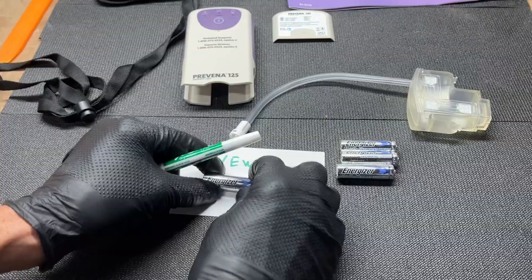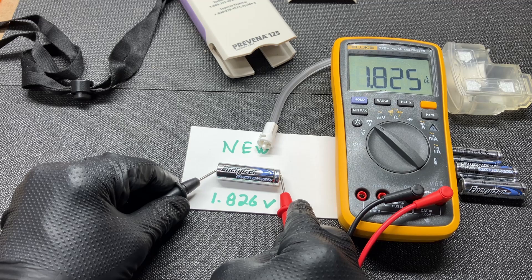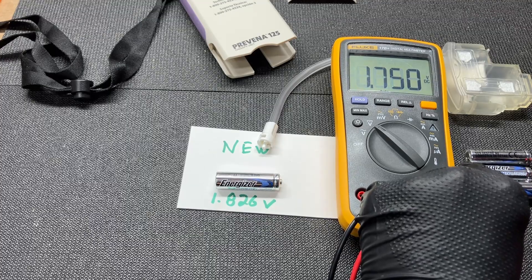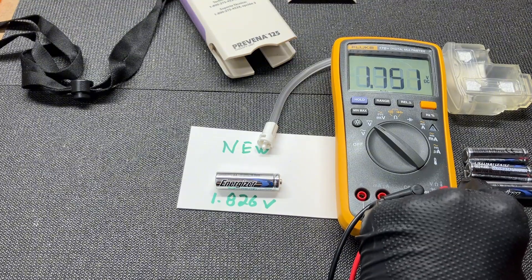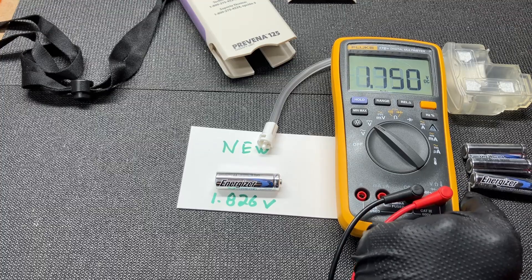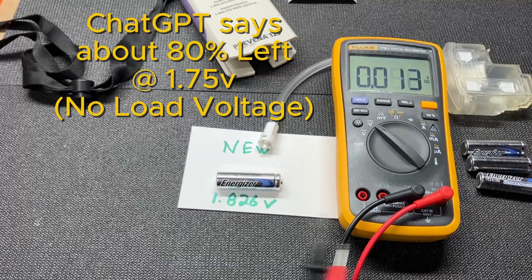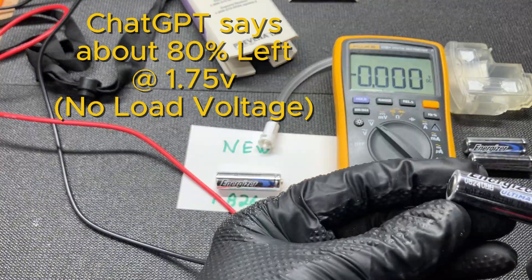Let's see how good these batteries are after seven days. A brand new battery reads 1.82 to 1.83 volts. Let's take a look at the voltage on these after a week of running — 1.75 volts. Surprisingly good. Even for lithium they do run a little higher voltage, but surprisingly, after a whole seven days of running this pump assembly, we're still at 1.75 volts. We can maybe look at that and see approximately the percentage of life left in these batteries.